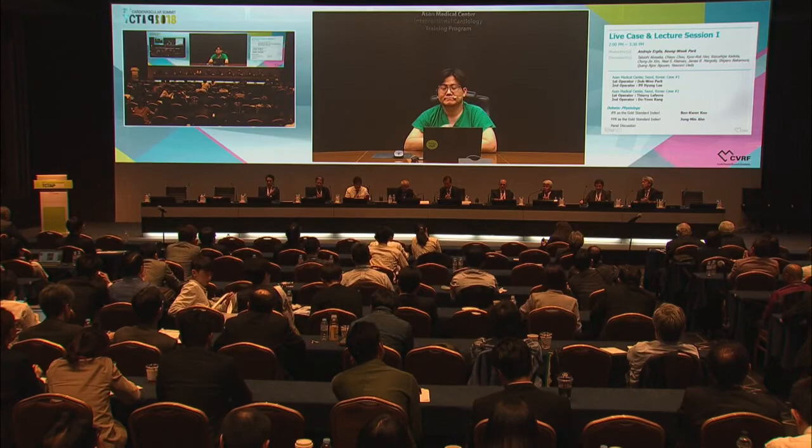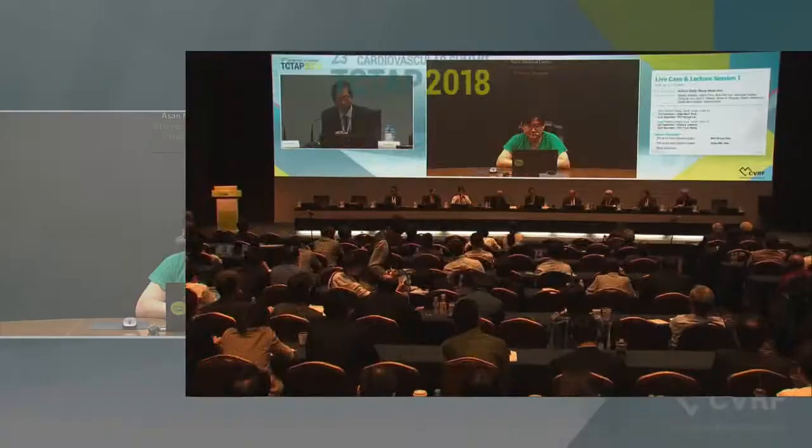Thank you, Dr. An. Now these lectures are open for discussion. Dr. Margulis. Thank you. I'm going to make some points. Neither FFR nor iFR are gold standards. The predictive accuracy of these tools is somewhere between 0.8 and 0.9, probably closer to 0.8. If you had gold in your repository that was only 80% pure, you would not consider that the gold standard. This is important because FFR is so much used now that it's a decision-making tool. An FFR of 0.81 says you don't do a case, and an FFR of 0.79 says you do. And that's, of course, ridiculous. It depends on the clinical history.